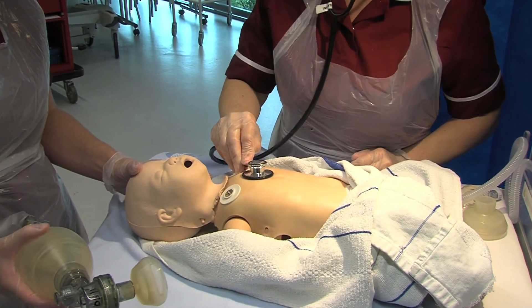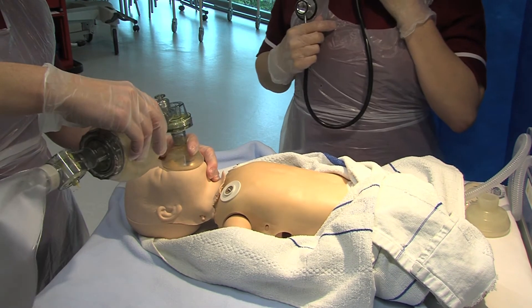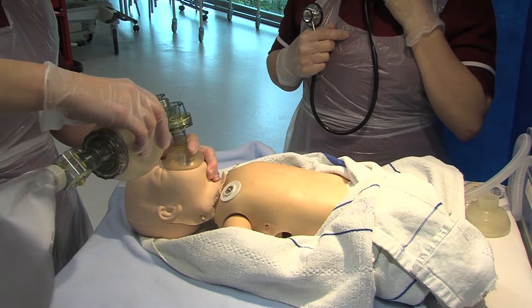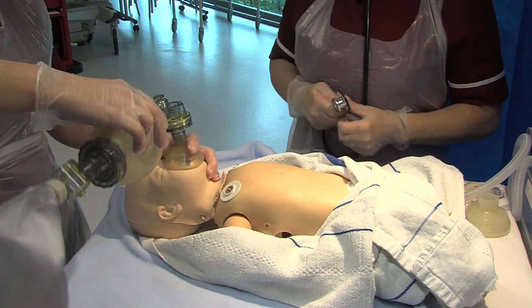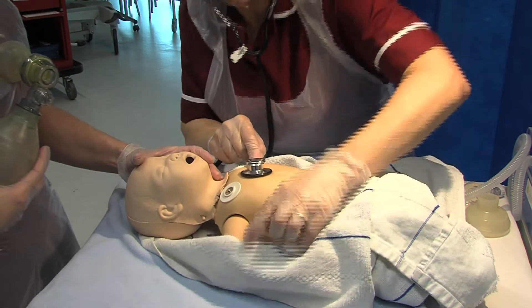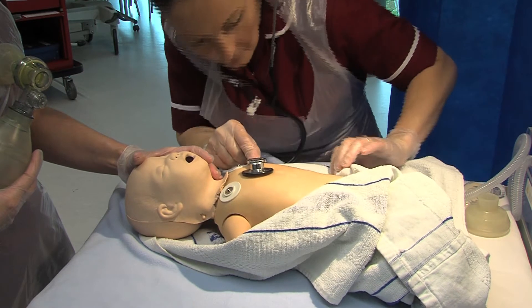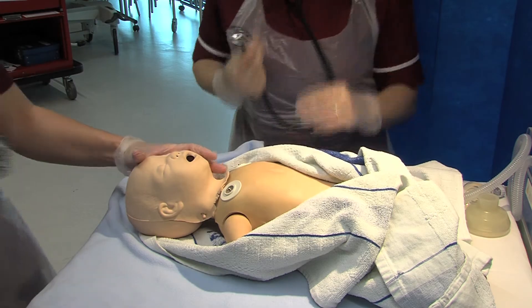Following 30 seconds of this sequence, it is important to reassess. If the baby's heart rate is above 60 and improving and present, however the baby is not breathing, continue with ventilation breaths at a ratio of 30 breaths per minute. Again, within 30 seconds of completing this, you must reassess again colour, tone, breathing and heart rate.